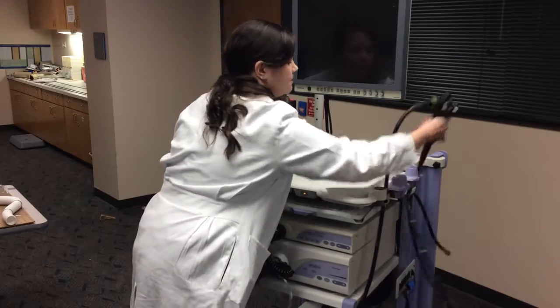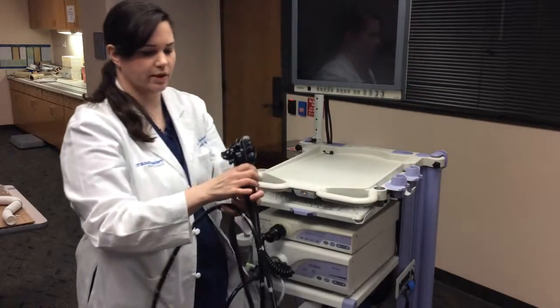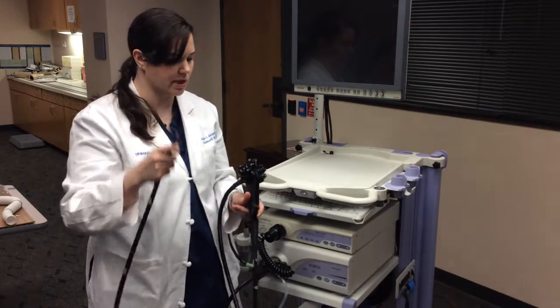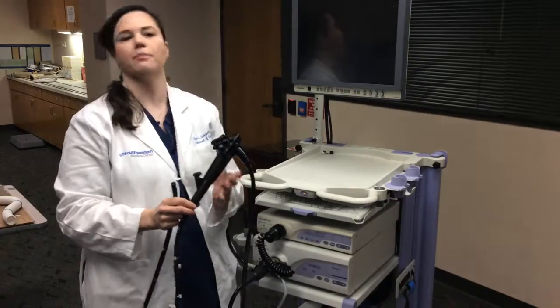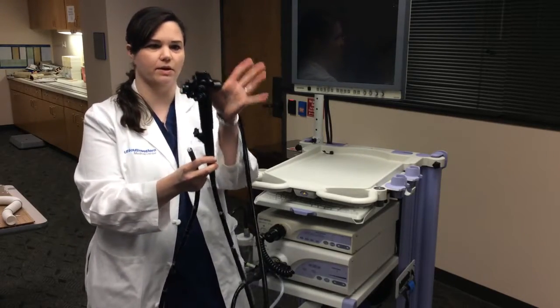Things about the scope. So please be gentle with these. One thing to remember is that this flexible tip can be broken if you use undue force. Just a couple of things about holding the scope. I like to hold the scope between my thumb and my index finger right here.